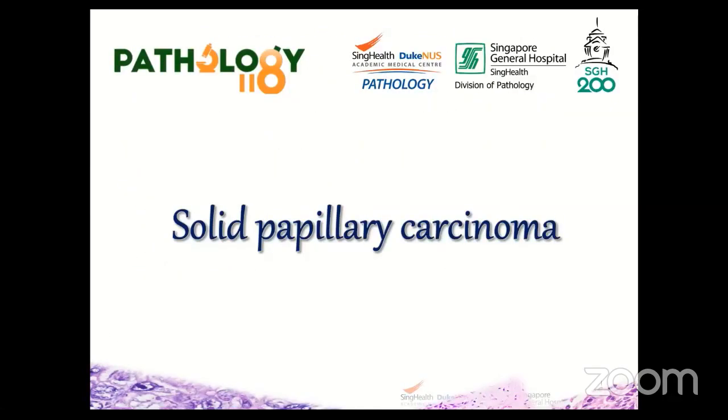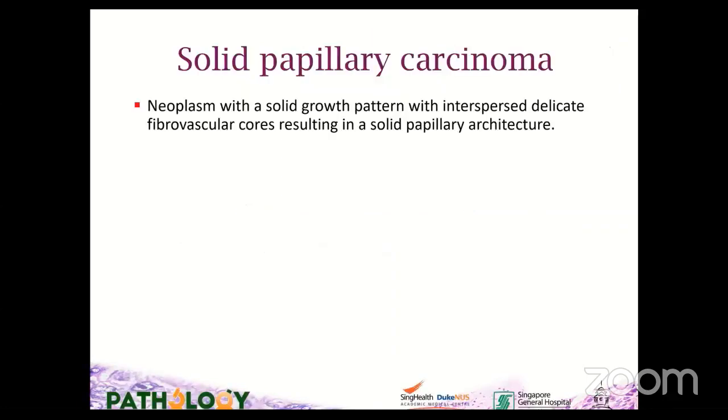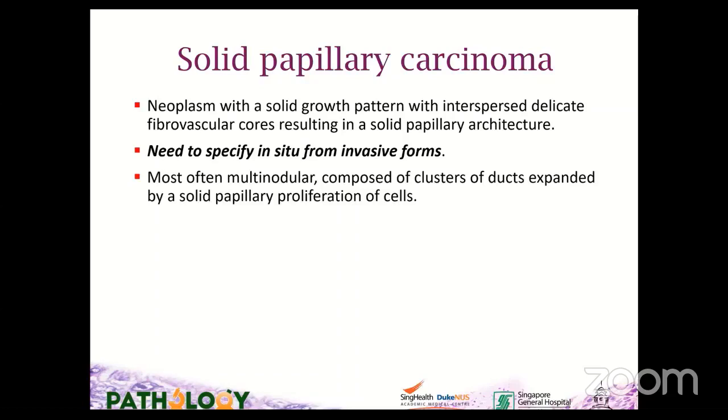The next entity is solid papillary carcinoma. The solid papillary carcinoma is a neoplasm with a solid growth pattern with interspersed delicate fibrovascular cores resulting in a solid papillary architecture. One needs to specify whether it is the in situ or invasive form of the disease.